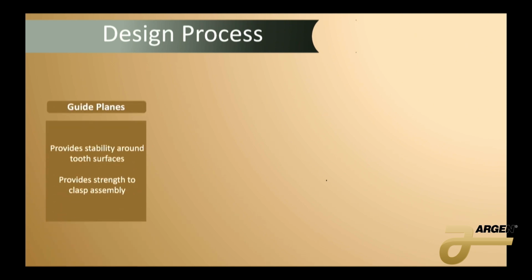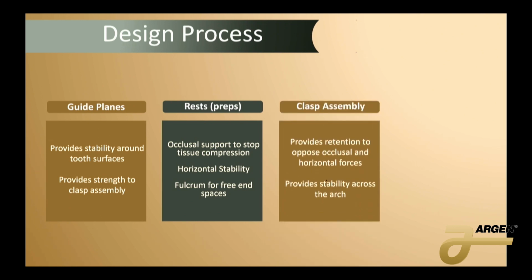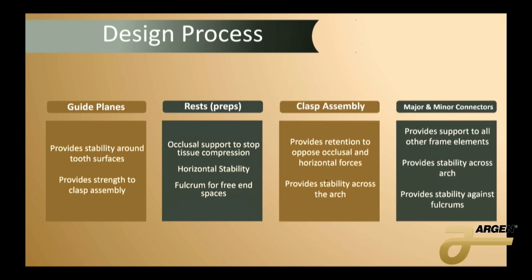So what we went through here, really basic intro. We went through guide planes, rest preps, clasp assembly, major minor connectors. So we're going to draw out some designs together based off of all those principles that we spoke to. I have about 6 cases here. I'm going to walk through the thought process, how you approach that.